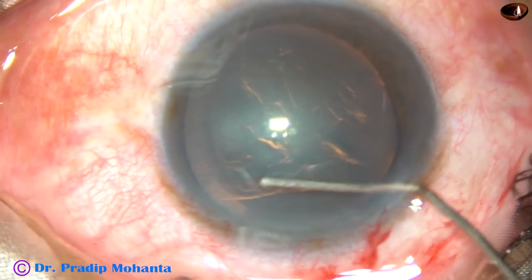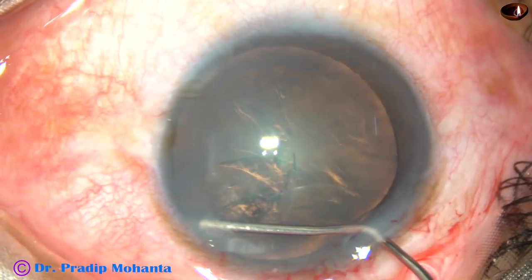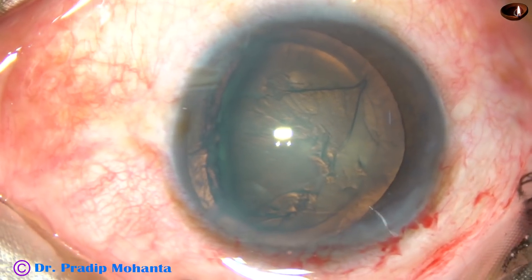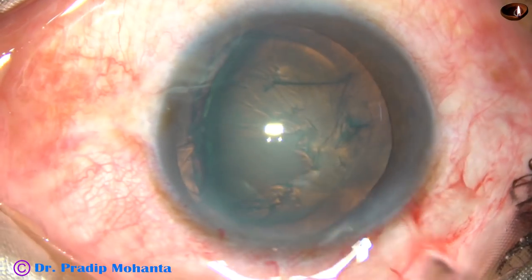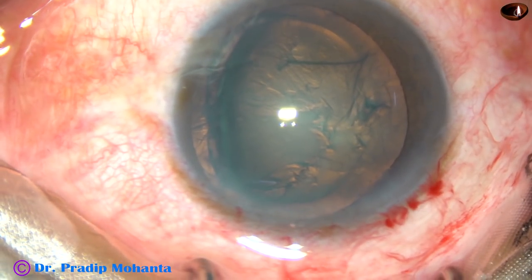Now, the hydro-dissection is being done, and hydro-dissection has produced the desired lens tilt.